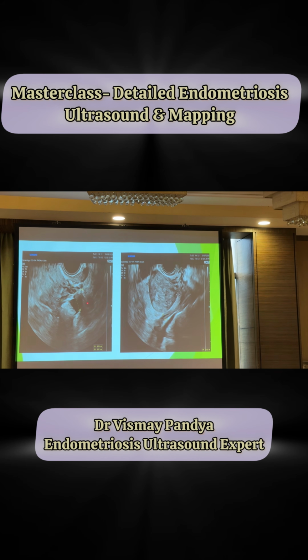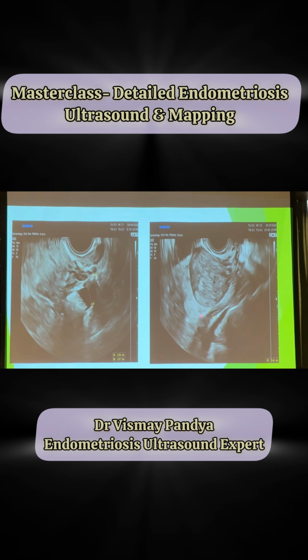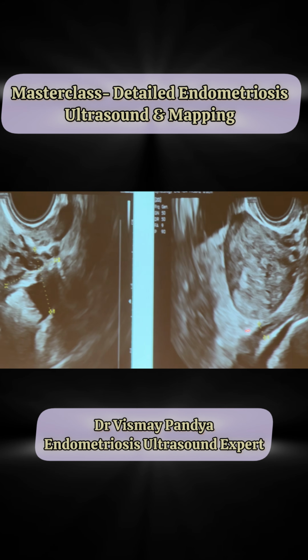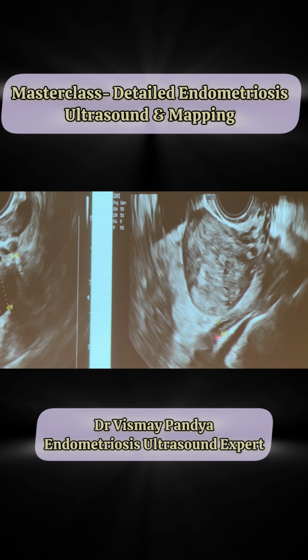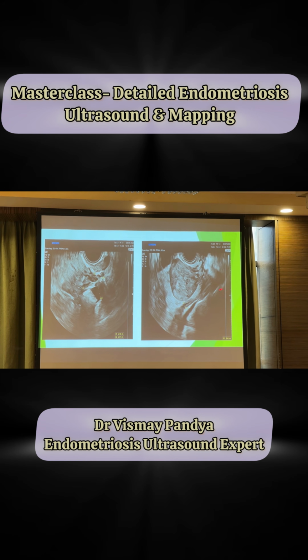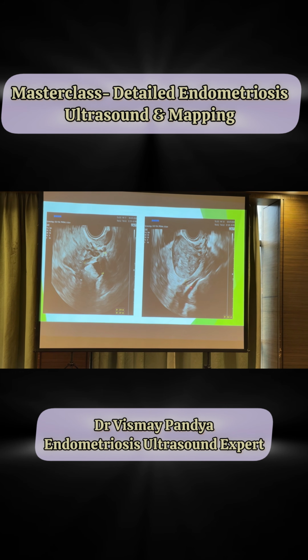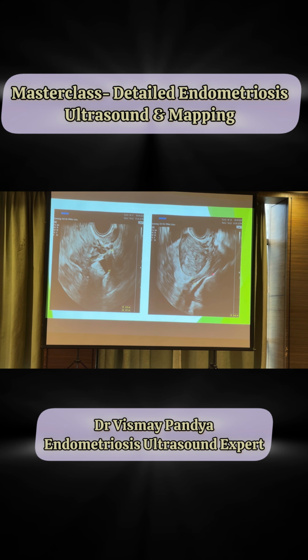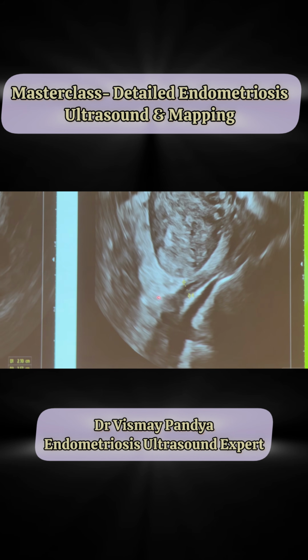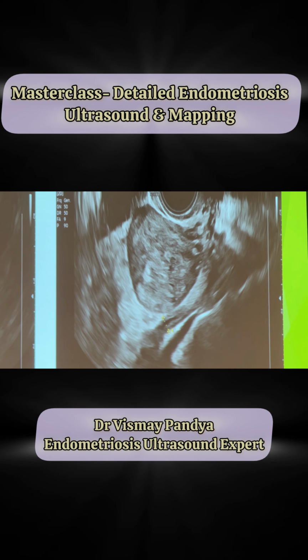This is actually a case of deep endometriosis of the posterior parametrium, and you can see the ureter. It is a myth that the ureter cannot be seen on transvaginal sonography. If you are trained, you can very easily see the ureter at the level of the ovaries and even at the level of the bladder. And you can see this hydroureter. It was around 7 millimeters. This is the artery. If you put Doppler, the Doppler will shine on this. The ureter won't take up Doppler. So that is the sign. And there was clear hydroureter which was diagnosed on transvaginal sonography.